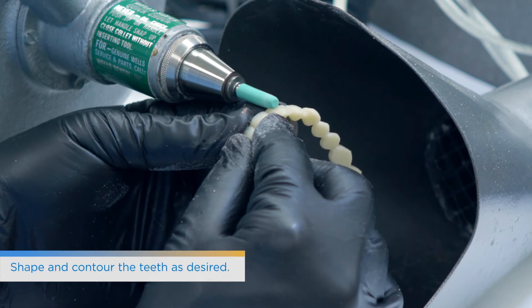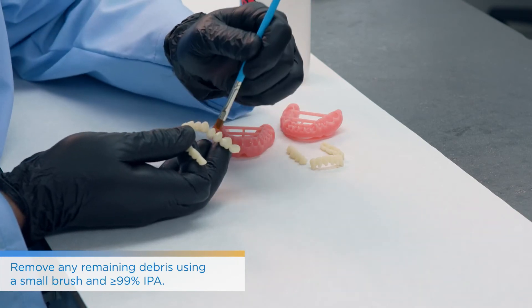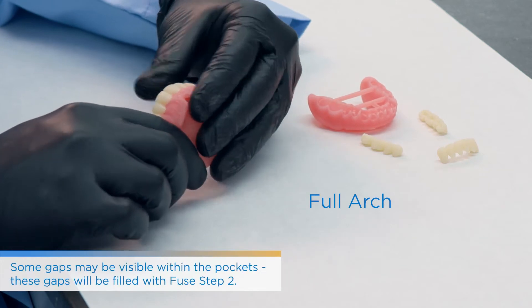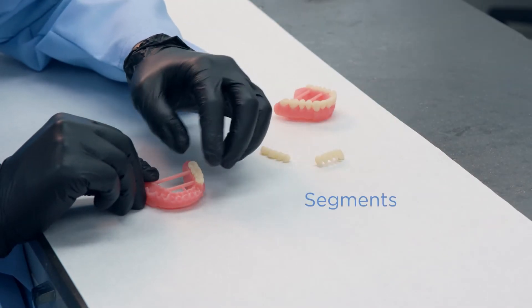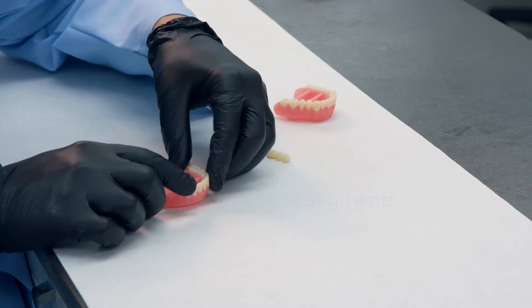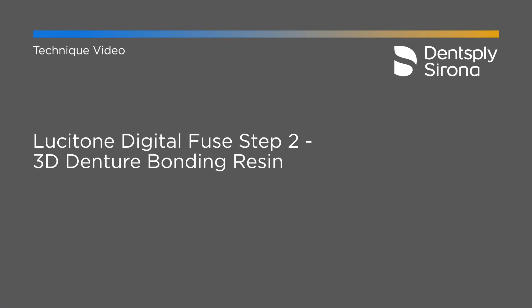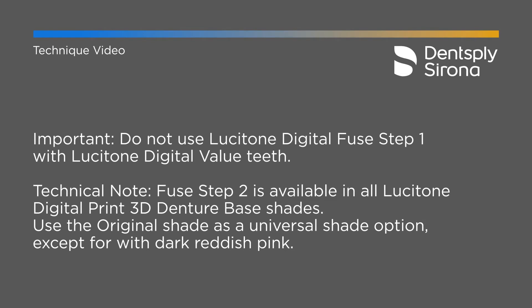At this point, remove any debris using alcohol to make sure there's no carbide burr dust or residue on it. Still do a dry fit to ensure proper fit and aesthetics — if any component is missing from an aesthetic perspective, take care of it here before fully seating, since you want minimal finishing at the end. Once the dry fit looks good, go directly to Fuse Step 2. Again, with Lucitone Digital Value printed teeth — or eventually the IPN 3D resin coming out this summer — do not use Fuse Step 1. Fill the sockets based on either a full arch or segments of teeth depending on how you've printed your arch.